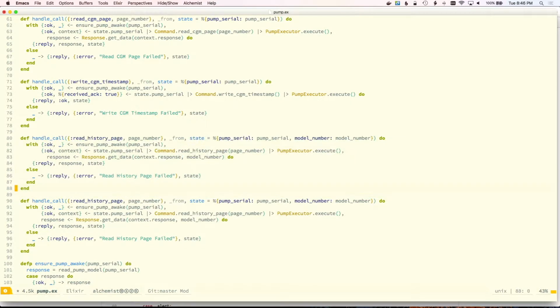I am going to, in a very non-embarrassed way, just copy that entirely. It's a spike. That's what I'm calling it. Although the code probably lives on forever, because that's how spikes work. All right, in this case, I don't believe that I actually need the model number. I'm going to guess that all the different models behave the same way and return the same data based on that call.